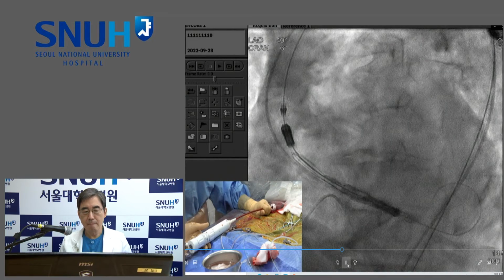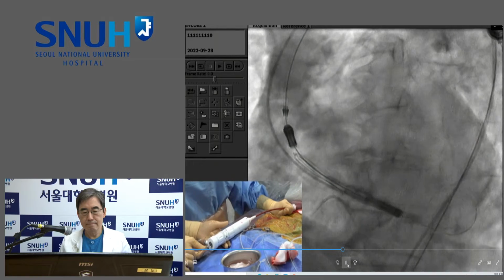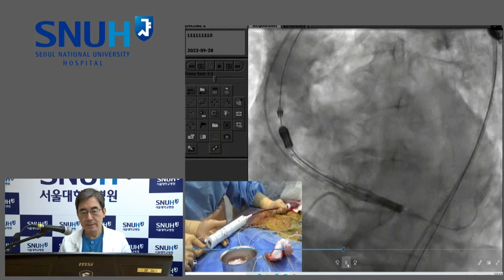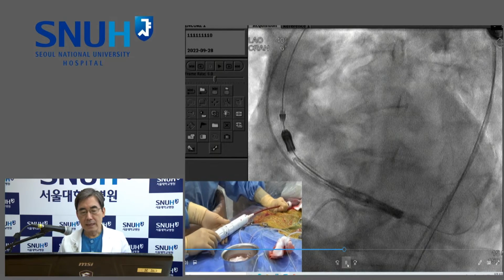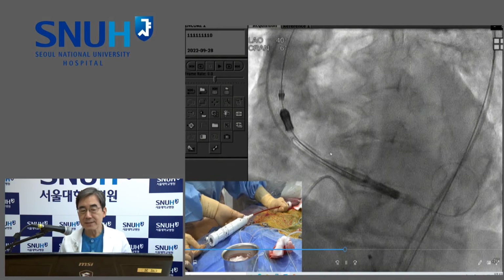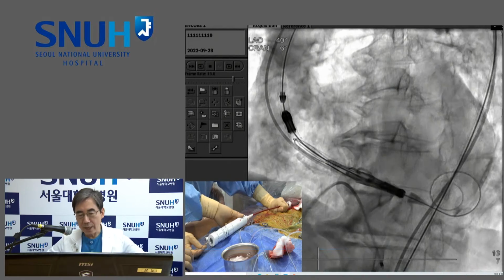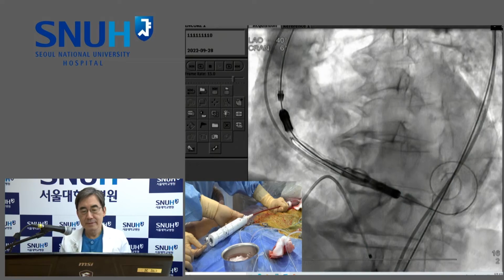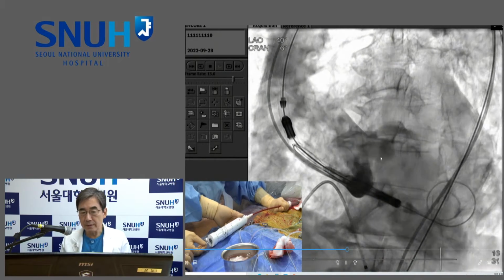Can you rotate it once it's crossed the aortic valve? With the new X4 Edwards, you can do fine-tuning of rotation. Can you do that with the Accurate 2? If the free cell is on the right side, you have to rotate the system clockwise. Here. The important positioning is that the marker should be at the annulus level.